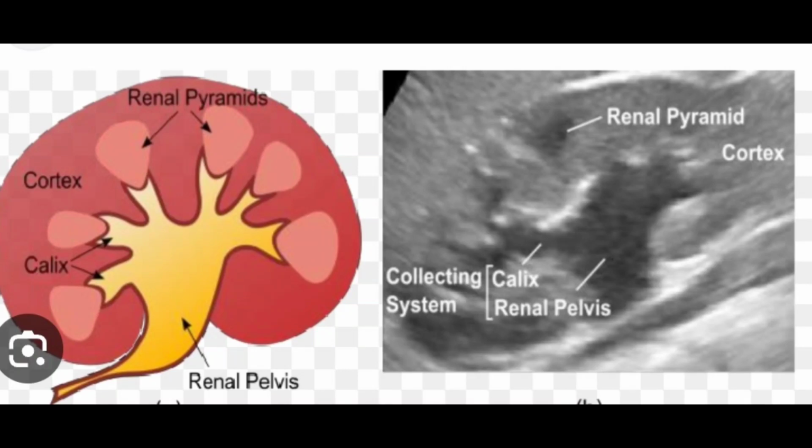Keep in mind that sometimes this may be because of overfilling of the bladder, and you would rather call it physiological. But if there is a true pathological process, ask the patient to go and empty the bladder, then after a 5 to 10 minute break, rescan, and if it still persists, it means this is a pathological process.